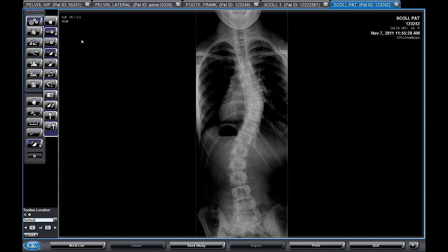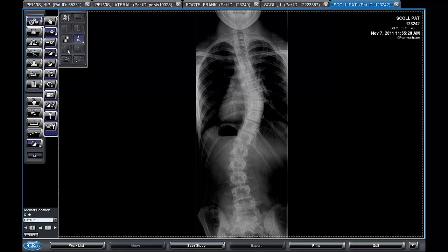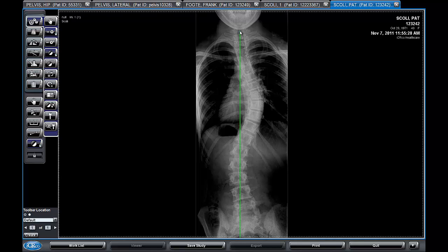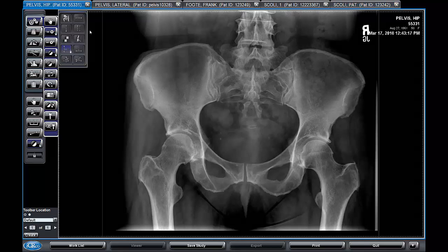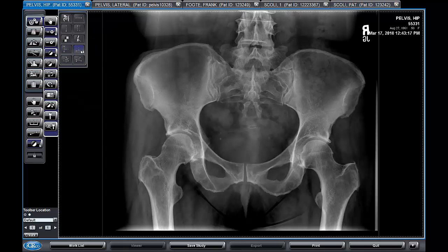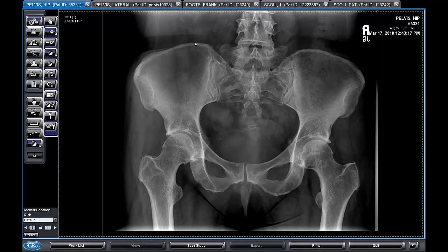We have an annotation for quickly determining the distance from a vertical line. We use this by single click to drop the vertical line and then single click to get the offset from that vertical line. We have the same thing for a horizontal line — we can drop the horizontal line and then get the distance.